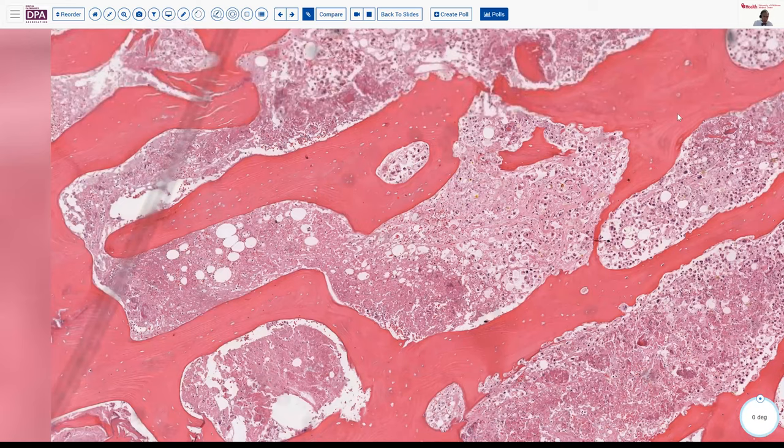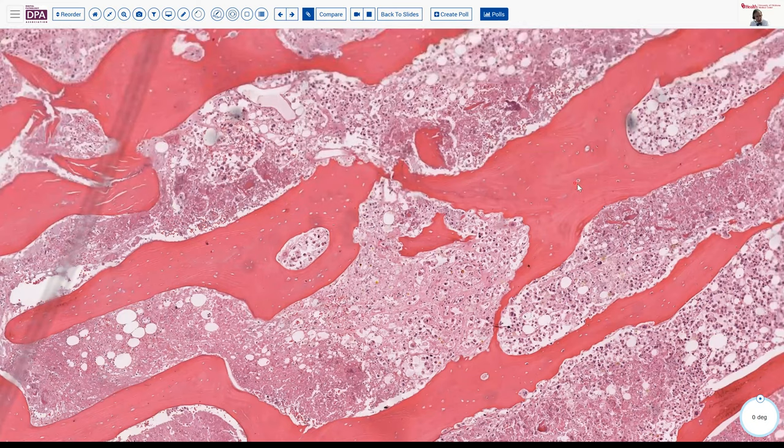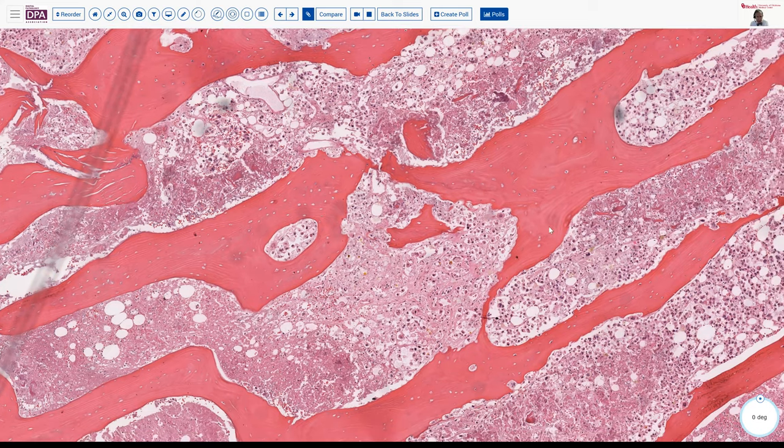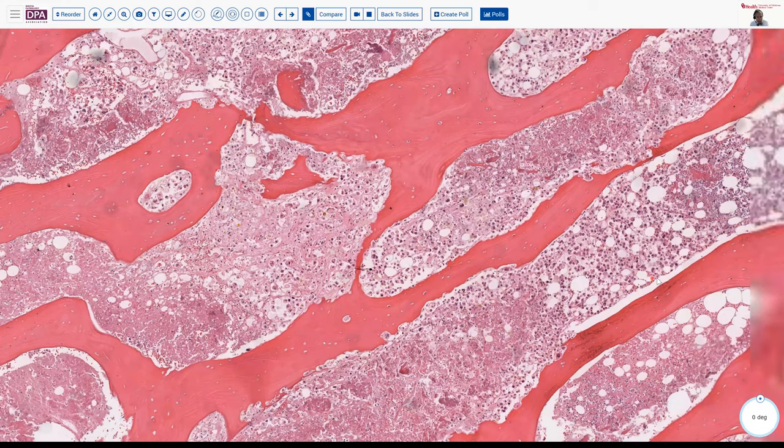So this is a situation where immunohistochemistry is going to come in. And this illustrates, I think, again, the importance to think about how you're going to use immunohistochemistry in a case like this, and to consider what the impact will be of decalcification. So typically, decalcification using acid will also affect the reactivity of many of the antigens that we rely on in immunohistochemistry. On the other hand, using EDTA, a chelating agent to decalcify bone, does not have the same damaging effect on the immunohistochemistry.